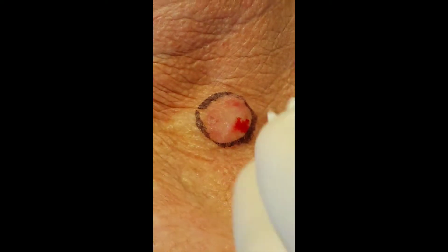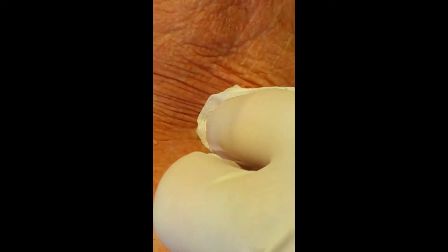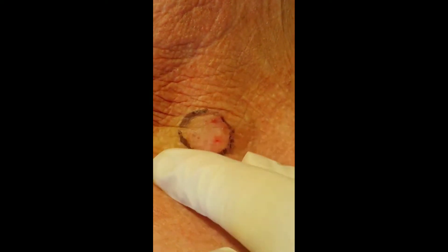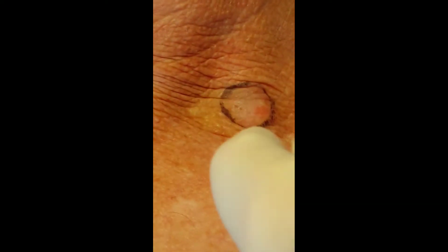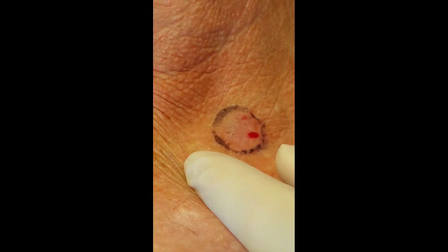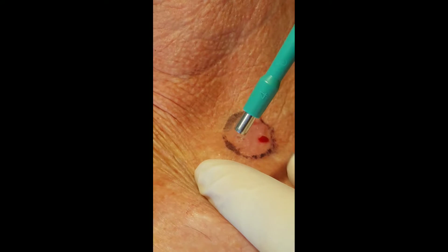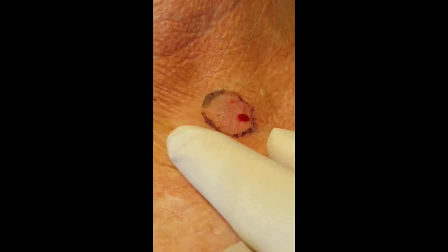Punch biopsies come in a range of sizes. 2mm punch biopsies really have no place in diagnosis now because of the small amount of tissue given to the histopathologist, which can lead to misdiagnosis. 3mm punch biopsy is adequate, though of recent times we're tending to go for 4mm punch biopsies, giving the histopathologist ample skin to look at.